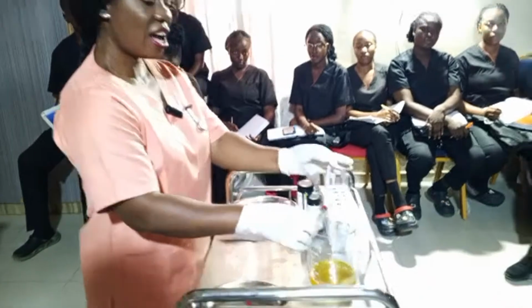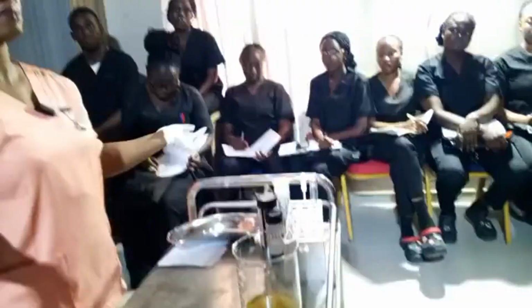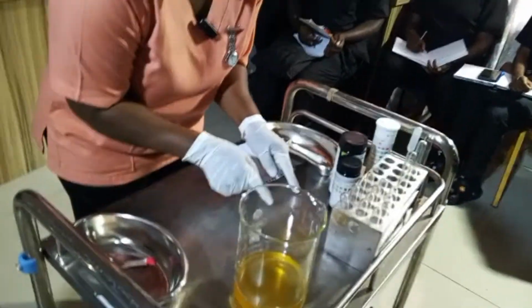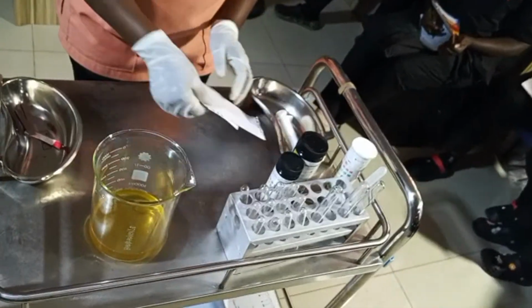Then you test, right? So now, since we have understood what I have taught you, any question? You return the urine back into the beaker and also put it in soapy water to rinse it, right? We rinse it. Remember, as a student nurse or as a nurse, you are carrying out this kind of procedure. Look at how I carry out my procedure. Clean, not a drop of urine on my table or on my trolley. Look at my paper, no stain of urine at all.